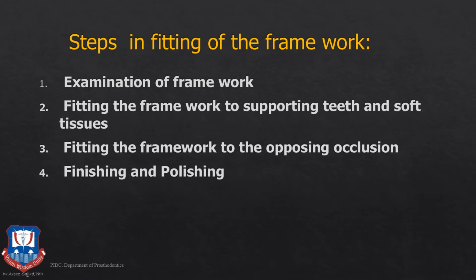The steps in fitting of the CPD framework are: first, we examine the CPD framework, whether it is cast properly, are there any nodules, any fins, any roughnesses on the CPD framework. The fitting of the framework to the adjacent supporting hard tissue and the soft tissue is examined first on the duplicated master cast.